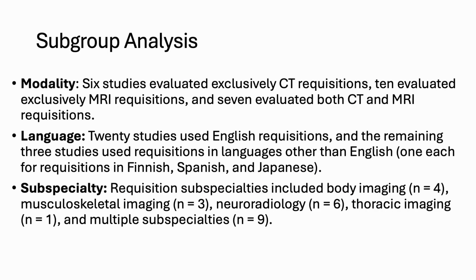To look further at the studies as subgroups, we did subgroup analysis on imaging modality, requisition language, and subspecialty. In terms of modality, 6 studies looked only at CT, 10 looked at MRI, and 7 looked at both CT and MRI.